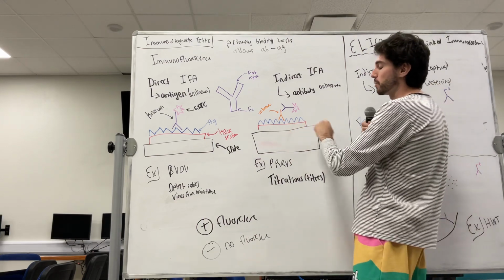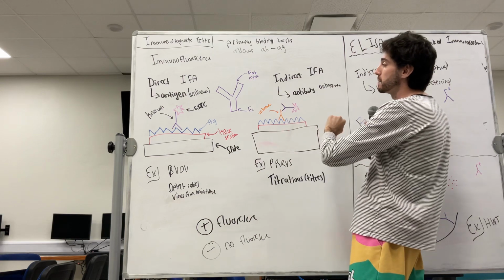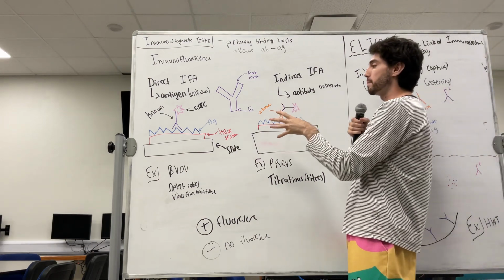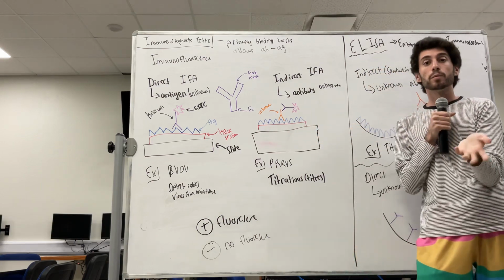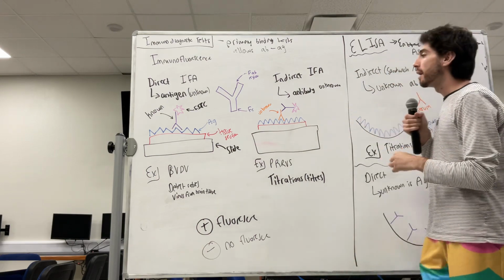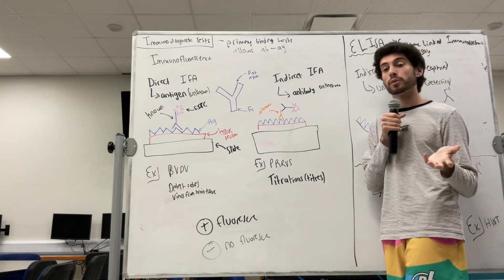And so what happens is we'll take our sample, we'll put the tissue section on the slide, and we have our antigens. So now our unknown is going to be our antibody, and our known is going to be an antigen. So we know what this antigen is. We'll put our patient's serum through this, and when we say serum, that's just whole blood minus the cellular components, so no clotting factors, no cells. We're going to spin that down and get the serum, which is where our antibodies are going to be located.